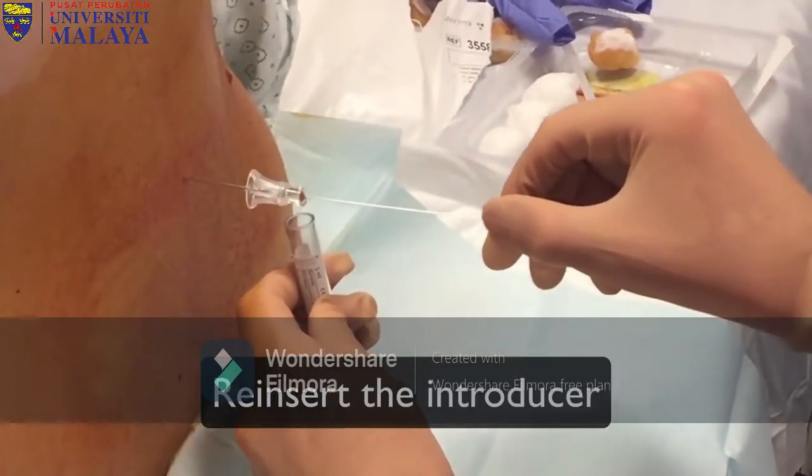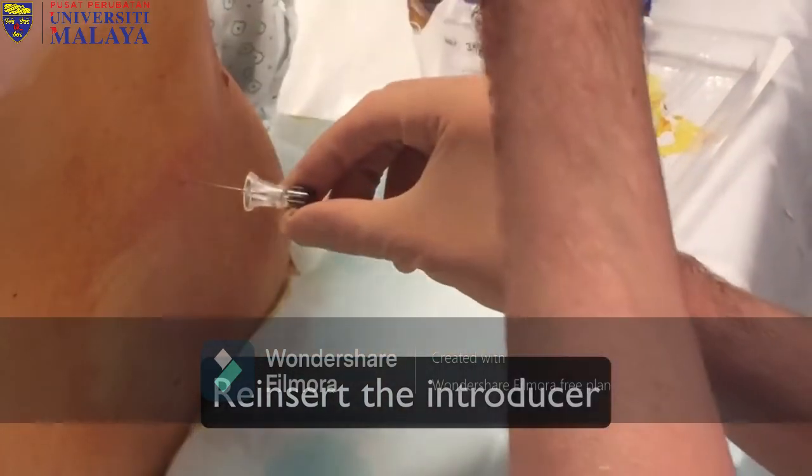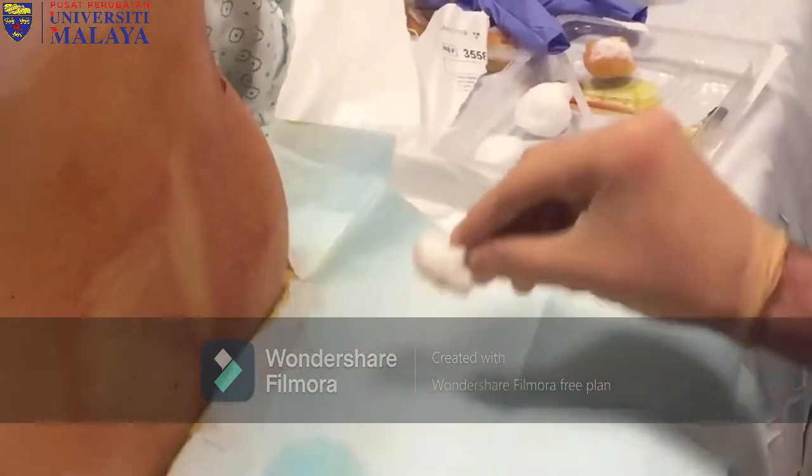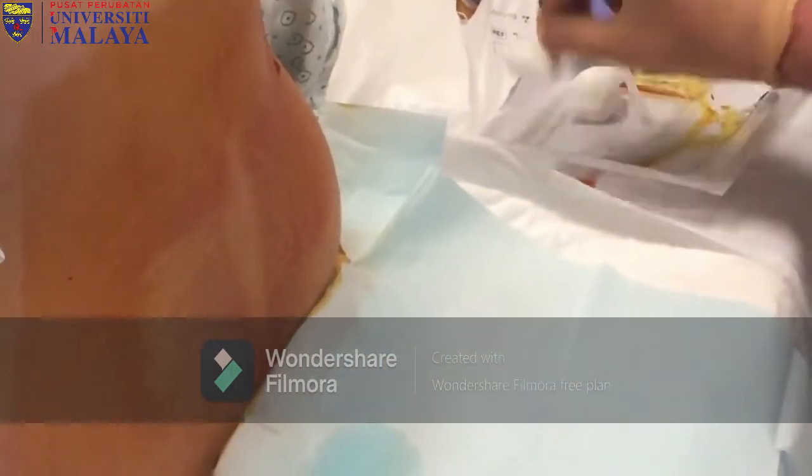Replace the introducer before removing the needle and slowly retract the needle. Lastly, cover the puncture site with an occlusive dressing and place the patient on the stretcher.